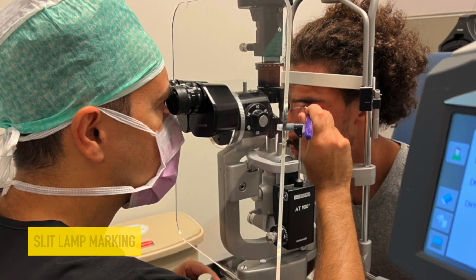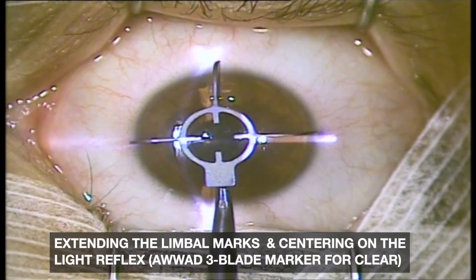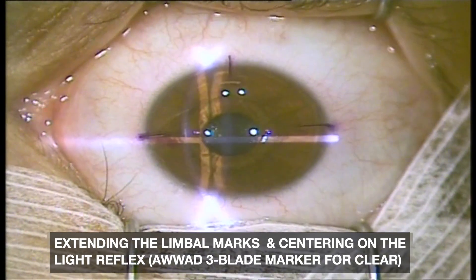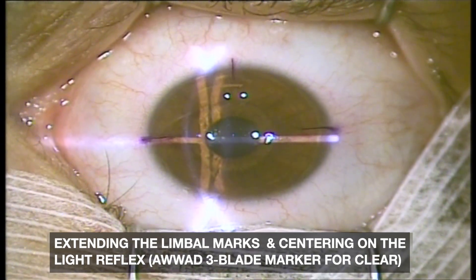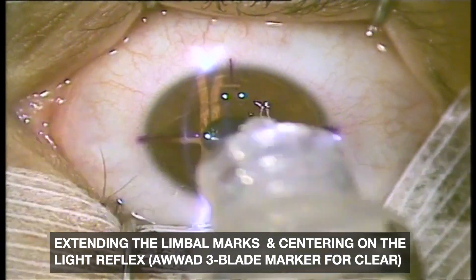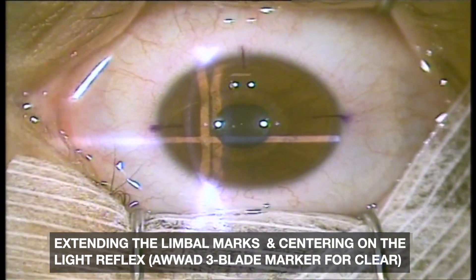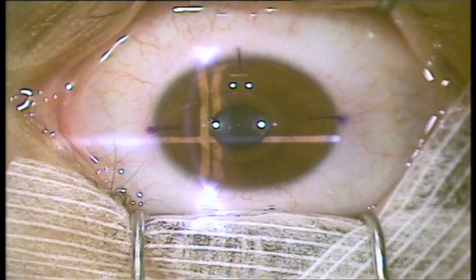Corneal marking at 0 and 180 degrees are performed at the slit lamp. Under the microscope, the limbal marks are extended into the cornea using the AWAD three-blade marker for CLEAR from Epsilon USA. The instrument is centered on the corneal vertex, represented by the blinking light reflex on the microscope.